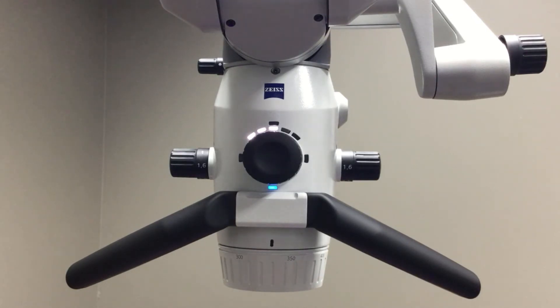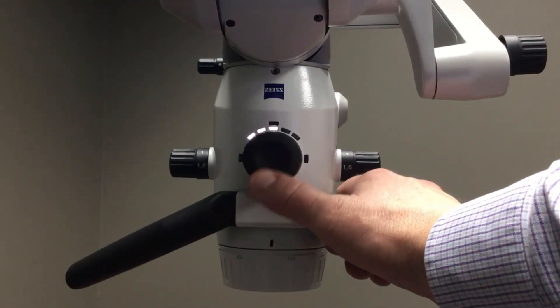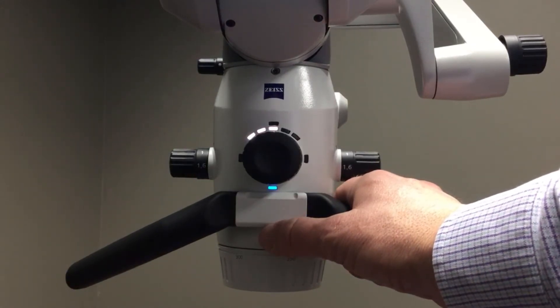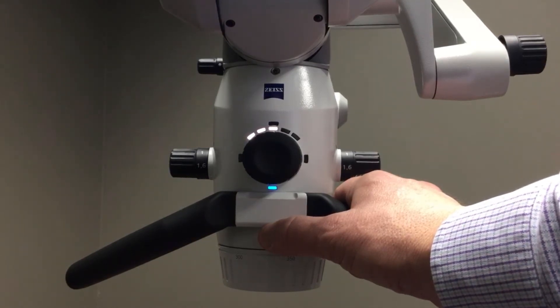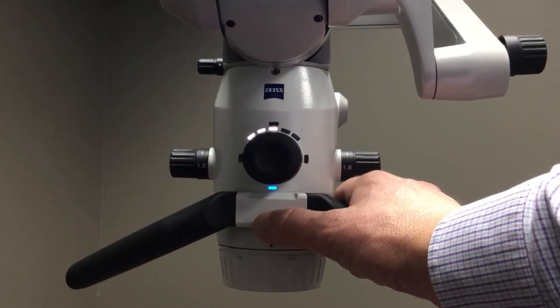So if you're doing a retreatment, sometimes it's very difficult to determine what is healthy tooth structure and what is composite. Because the fluorescence mode illuminates them differently, it gives the operator great visualization of the two different components, so you can ensure that you've removed all of your composite properly.